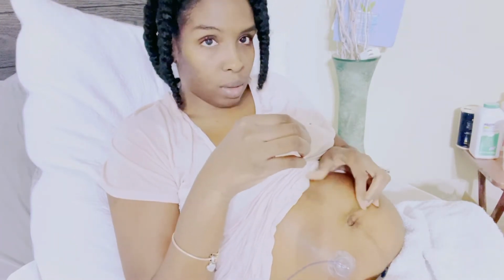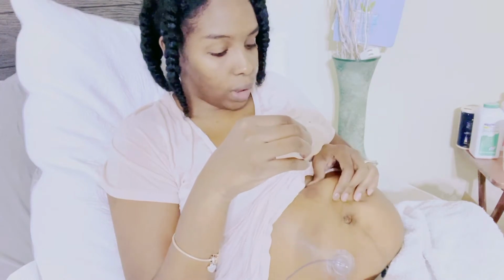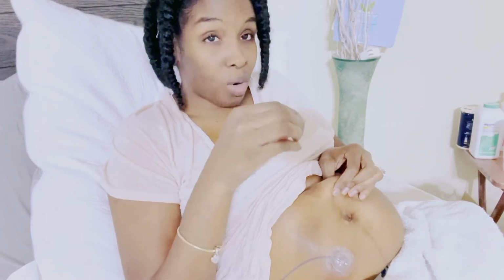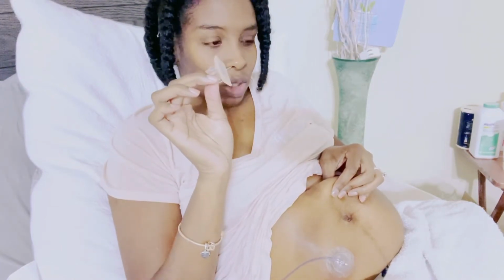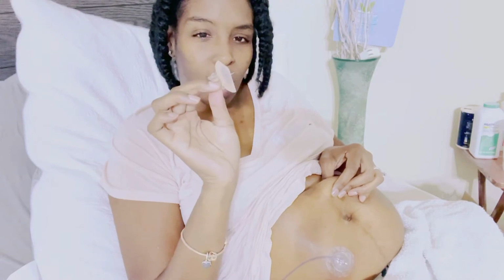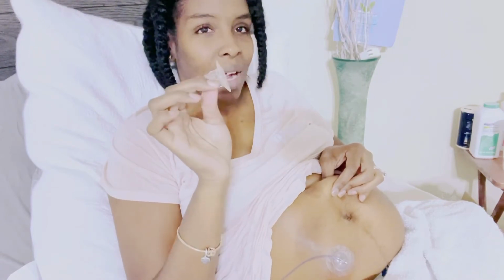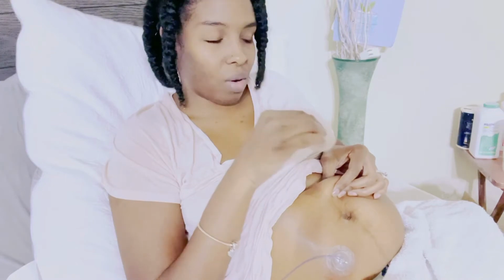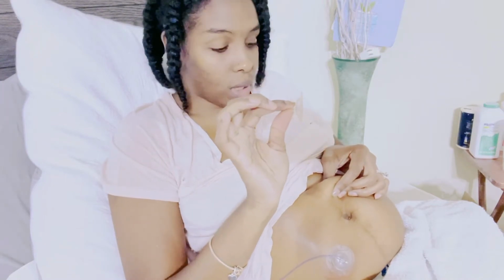They said this helps it not hurt as bad, but really it just keeps your skin, to me, kind of firm as well, because it is hard when you press this in. It's like your skin is so tough. Until you have to stick your own skin, you start to realize how tough skin really is. Skin is thick. Okay, so I'm gonna stop talking while I'm doing this part because it hurts.